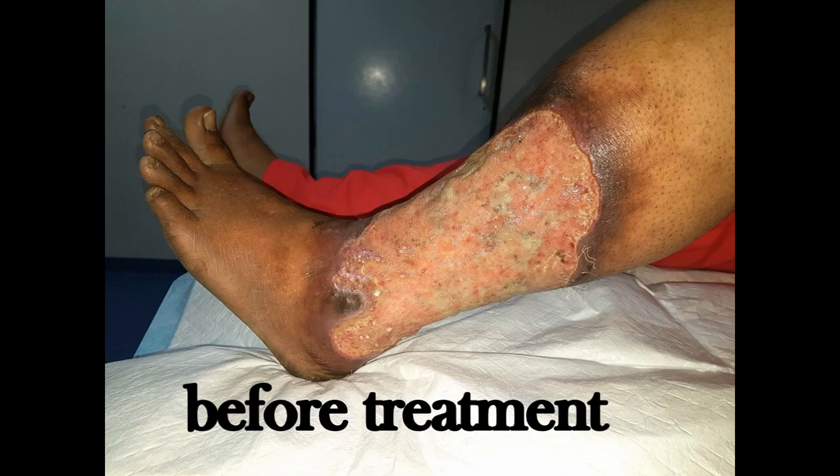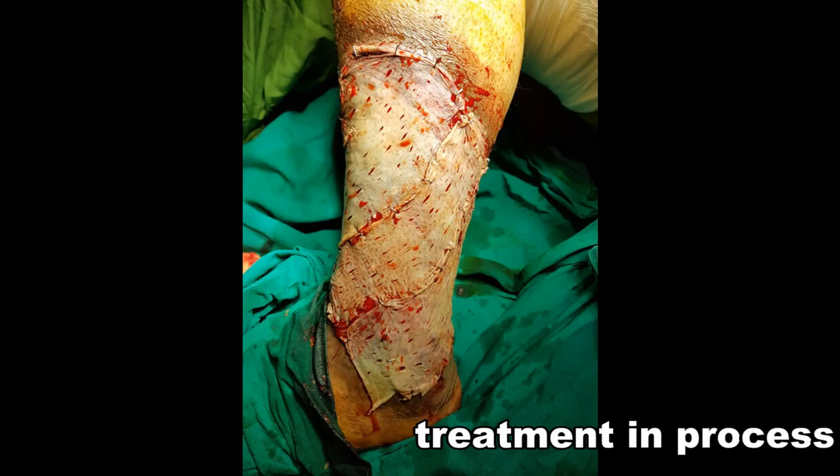Once the ulcer was healed after debridement and skin grafting, we put the patient on compression bandage. For the last seven to eight months the patient is doing so well — the ulcer is healed, skin color is improving, limb edema has completely resolved, and patient compliance is extremely good. This is a live example, and we will be showing photographs as motivation for other patients suffering from chronic venous diseases.